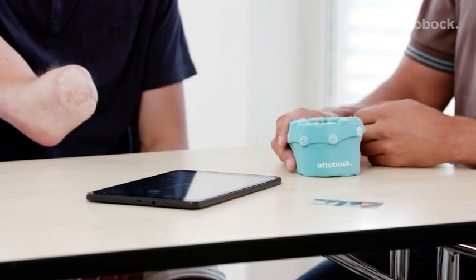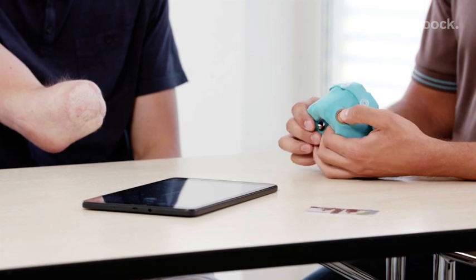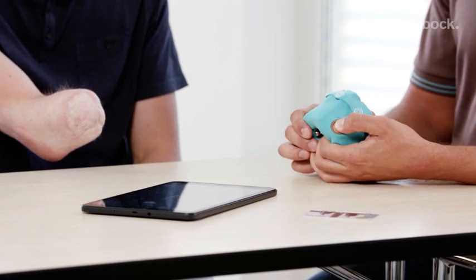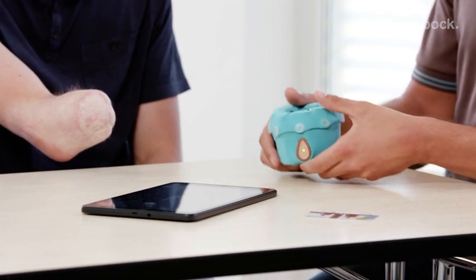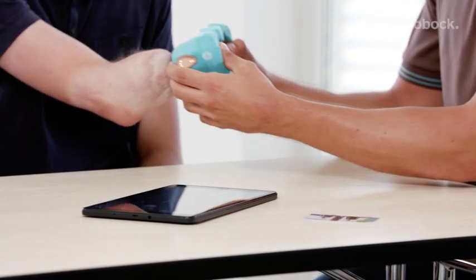Turn on the Myo Cuff by pressing the charging receptacle for 2 seconds until the LED lights up green.